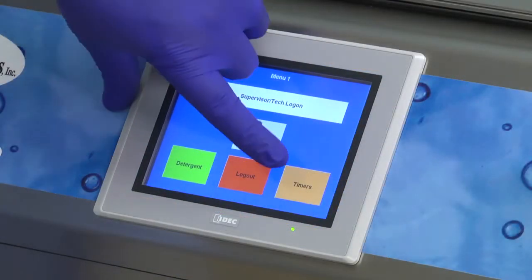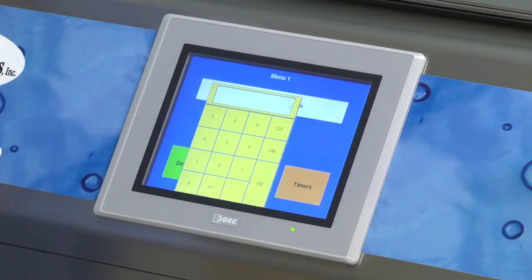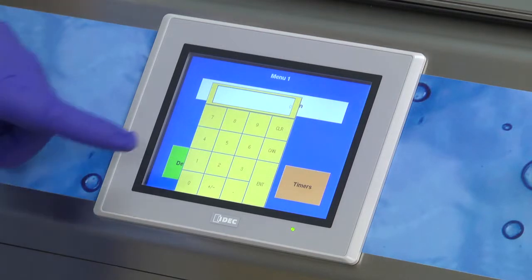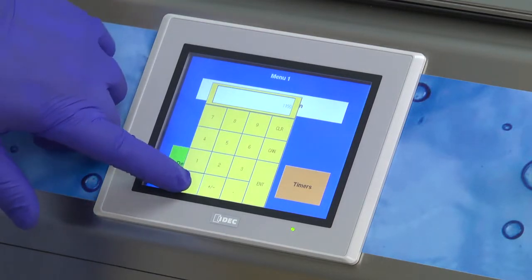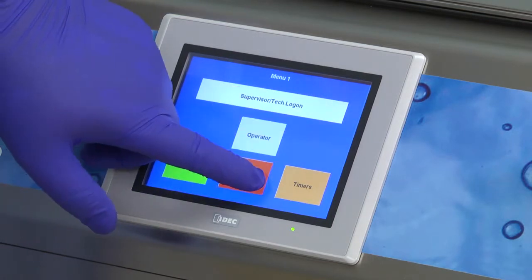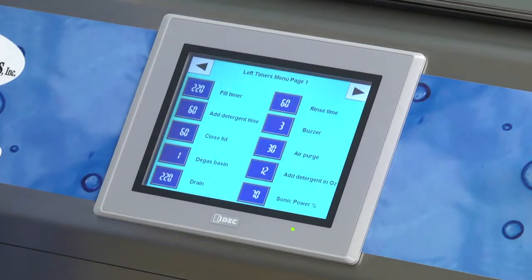To adjust the preset timers, select the timer button from menu one. A number pad will pop up to enter an authorization code. Since this is the model 1150, the authorization code is 1150, followed by the enter button. This gives you access to change the many timers in your machine, as well as other settings. These settings should only be changed by supervisors or technicians.